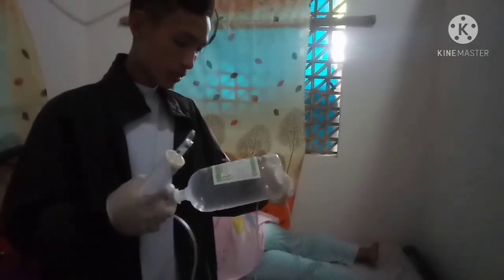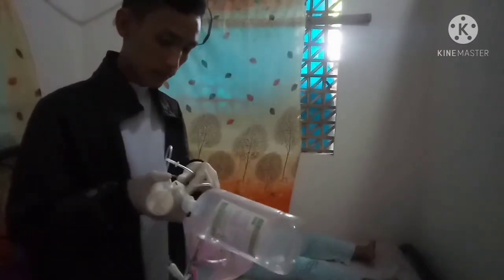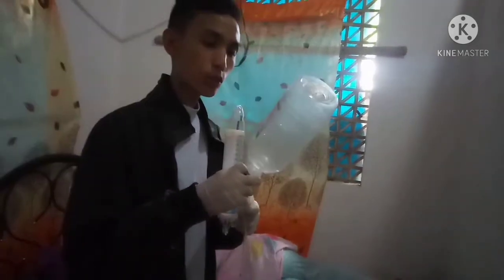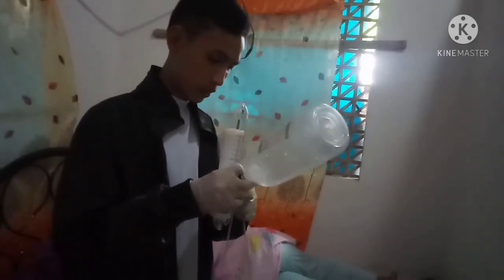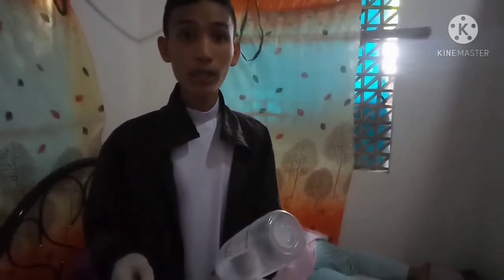So we will prime the tubing to remove any air. We will open the control as if there is a solution inside. After we have primed it, make sure that we have a commode, a basin, or that the CR is free for the patient's use after the administration of our enema.